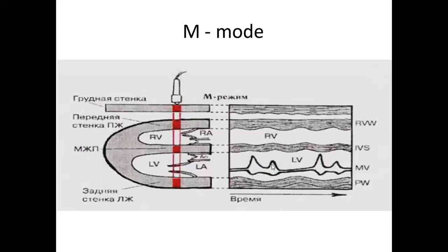because then we have the actual systole of the atrium. And as a result of this contraction, of this active pumping of blood from the atrium to the ventricle, you can see this second part of the movement of the leaflet. So again, at some shorter distance, you are seeing how the anterior leaflet again is going upward and the posterior leaflet is going downward, which means that they are opening again.